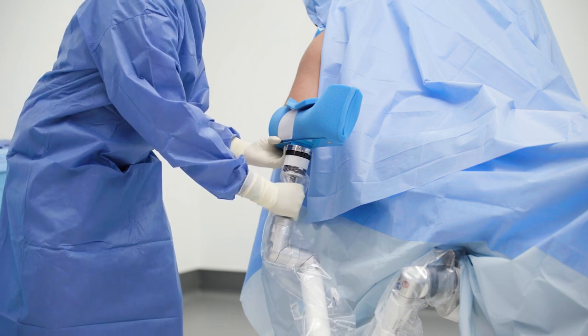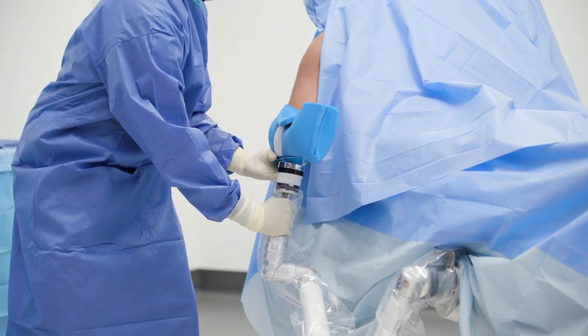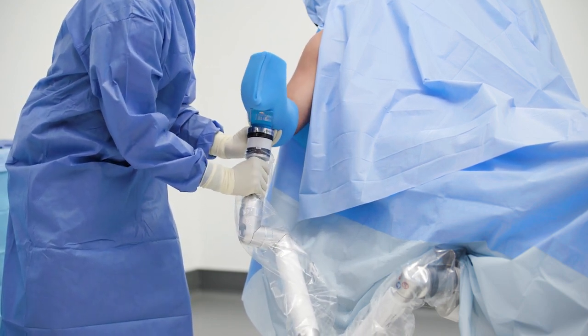The surgeon can precisely position the patient's extremity by simply pressing and holding the quick release handle.